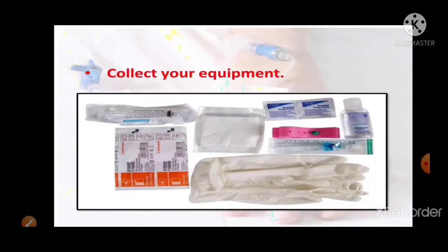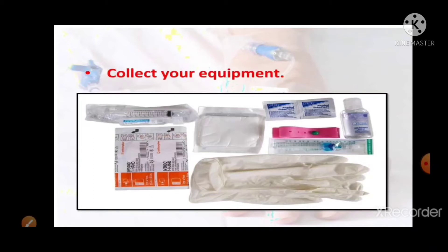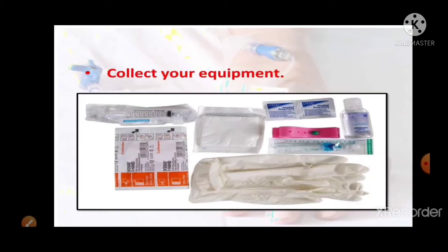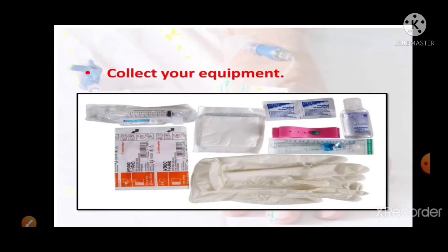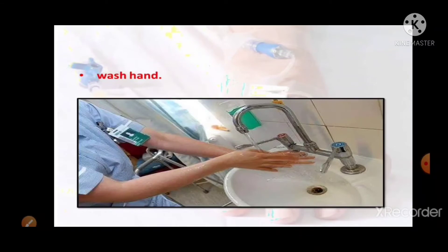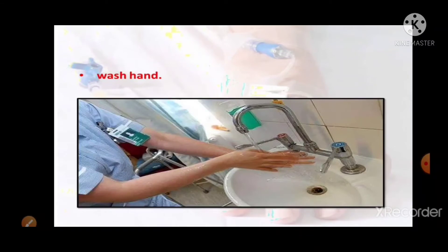Collect all necessary equipment and wash hands properly before proceeding.